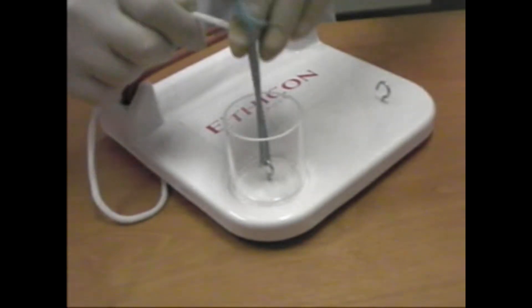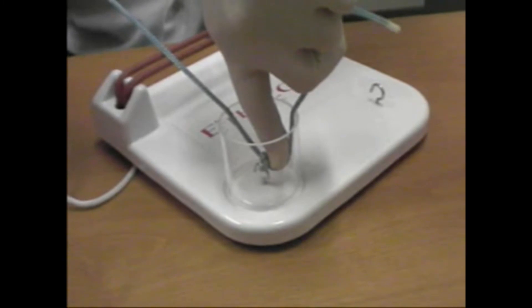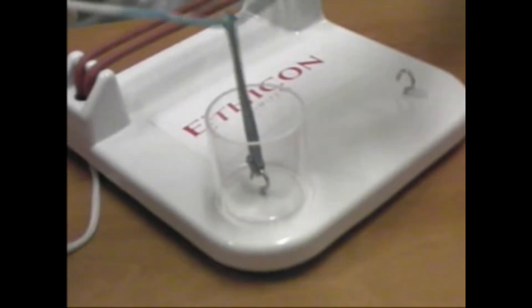When tying a deeply placed vessel, it is important that the surgeon takes the knot down to the vessel, rather than pull the vessel upwards, which would risk avulsion.